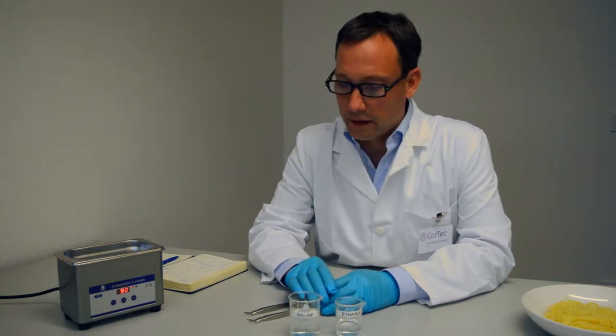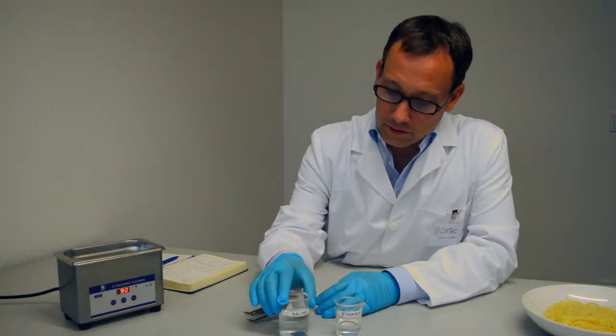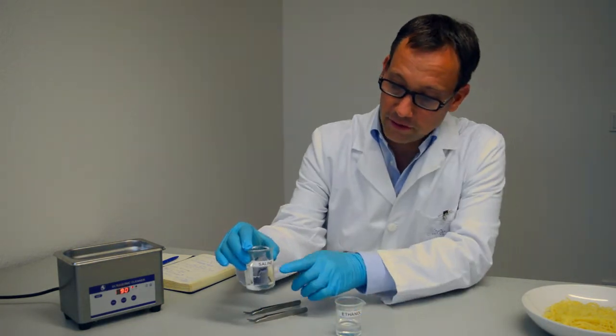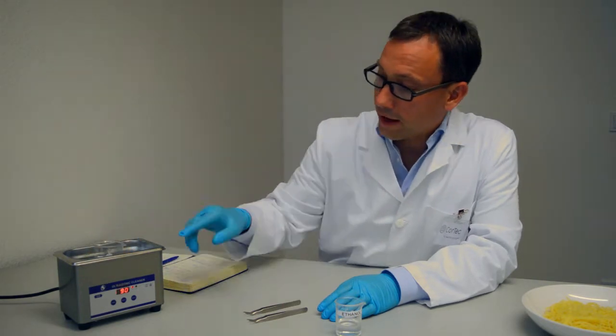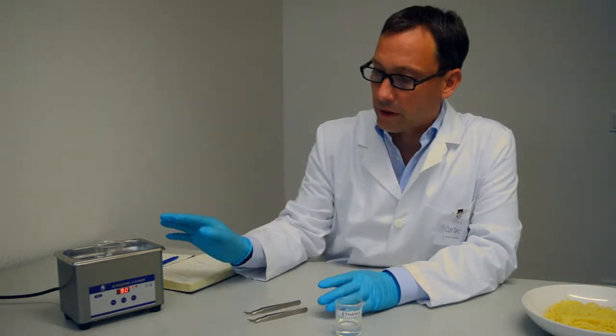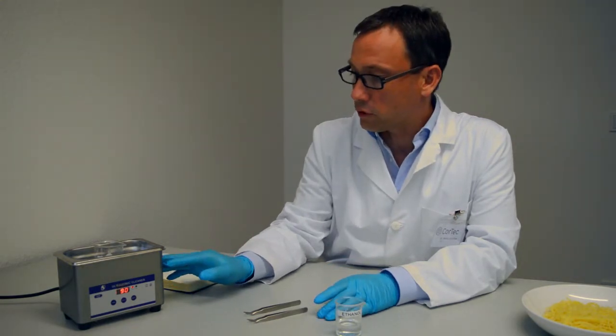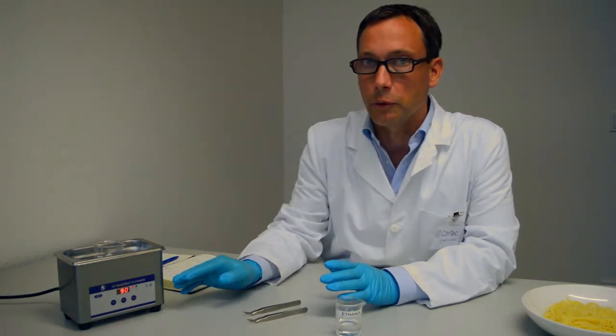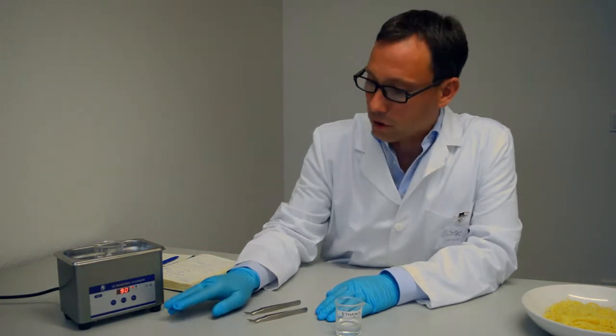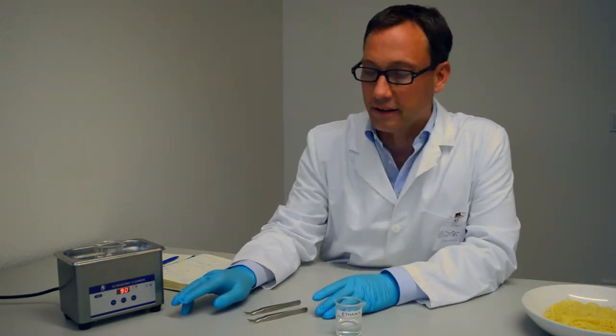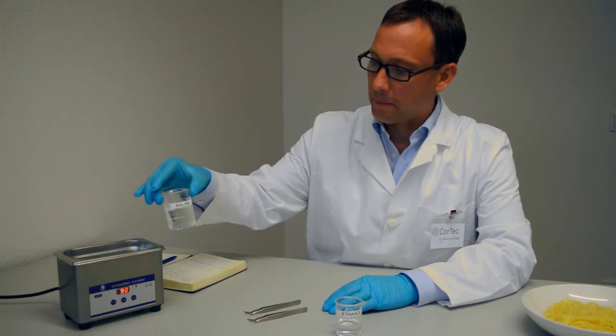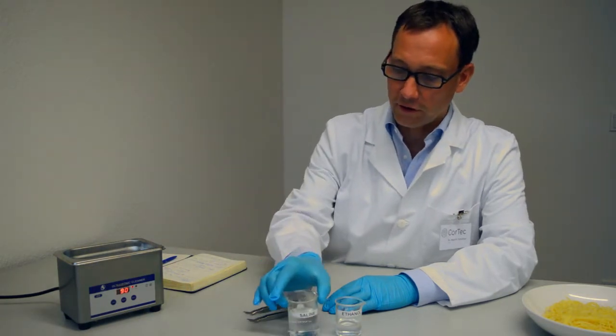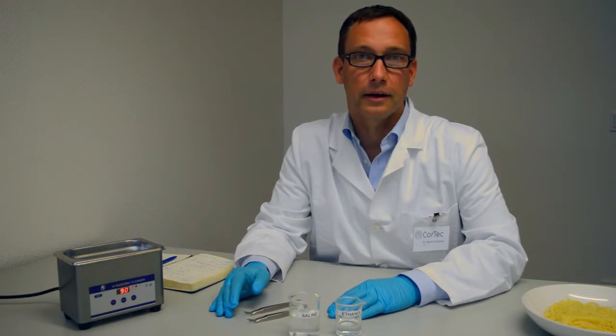In this case we recommend sonicating the electrode in the saline. For that we have a small ultrasonic tank. This one has about 800 milliliters of filling volume and 35 watts, so it's a really weak ultrasound, and we apply the ultrasound for not more than 90 seconds. Now all the bubbles should be removed from the surface of the cuff electrode and it is ready to be implanted.